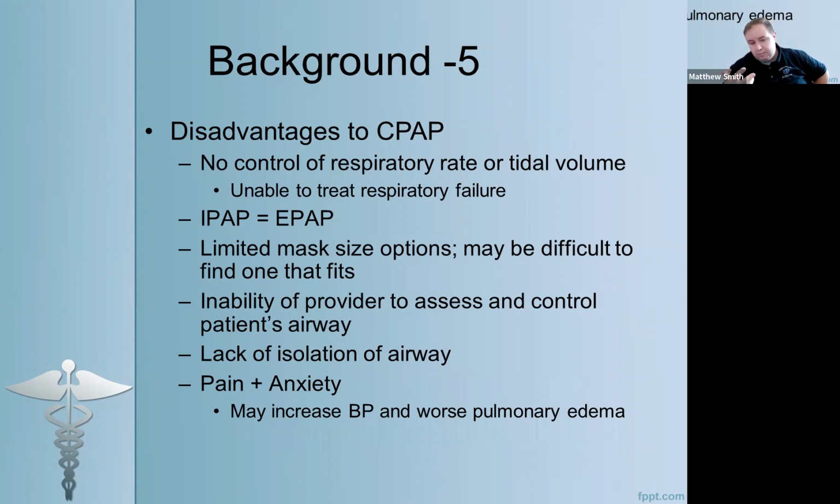The problem with those patients becomes less about hypoxia and more about hypercapnia, or a buildup of CO2. They're unable to get CO2 out. And you can imagine that if I'm pushing continuously on the lungs and I have a patient that's already impaired from an expiratory state, that's not going to do them any favors in terms of solving their air trapping problem.